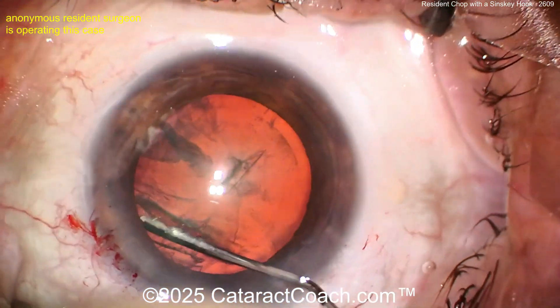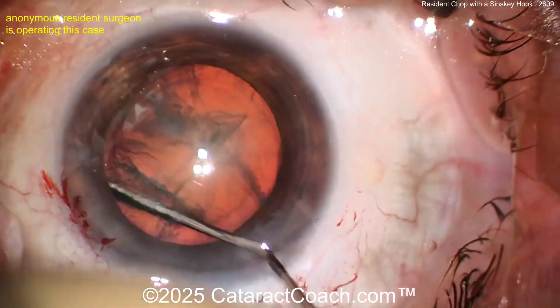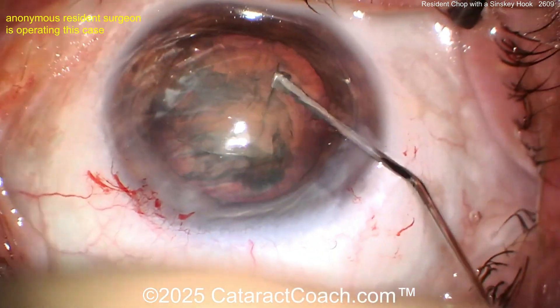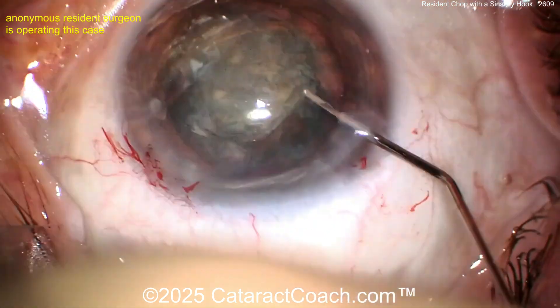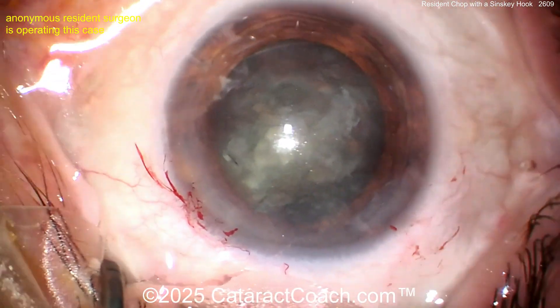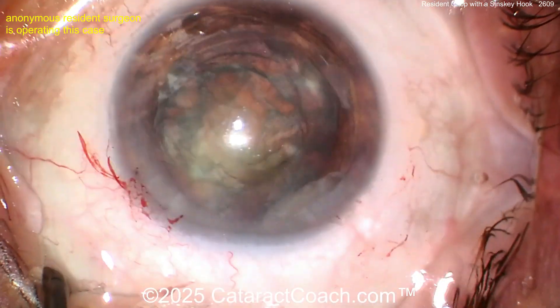I don't like your draping either — it still bothers me — but I'm going to be quiet and focus on the case. Here's some hydrodissection. It definitely spins well. You know the saying: if it does not spin, you will not win. That's pretty good. Now let's see the technique — a little more viscoelastic. Good job.